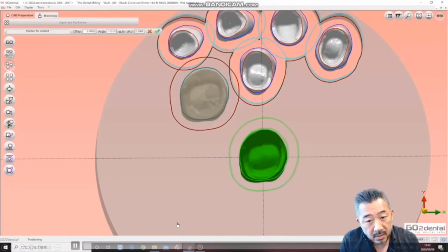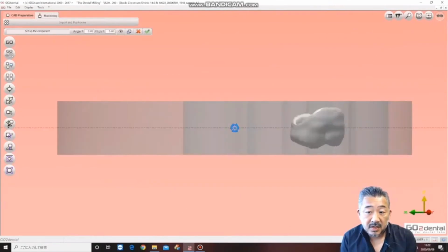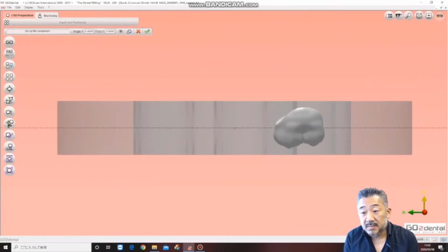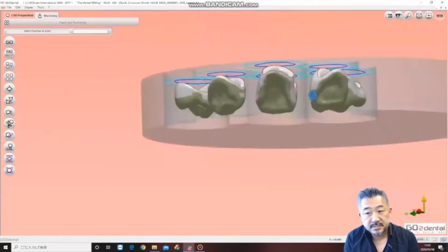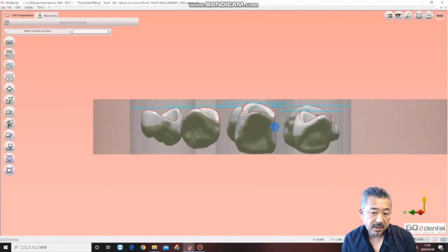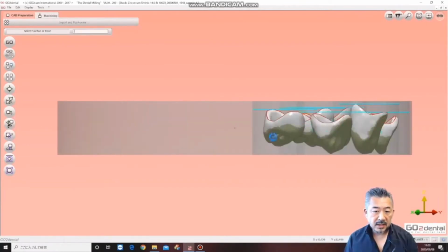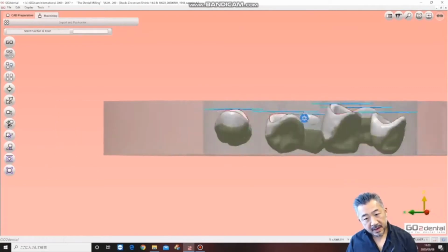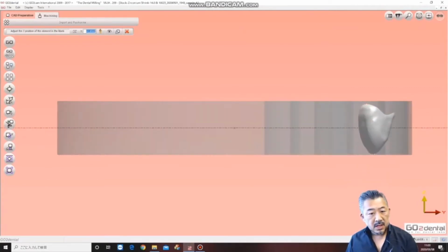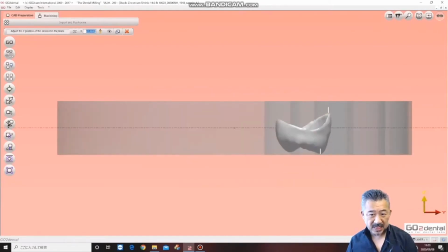Okay, when all the arrangements are done, rotate the crown or move the vertical position. A multi-layer disc has several layers with different transparency, so if you want it to be as transparent as possible, place it inside or at the edge close to the bottom of the disc.